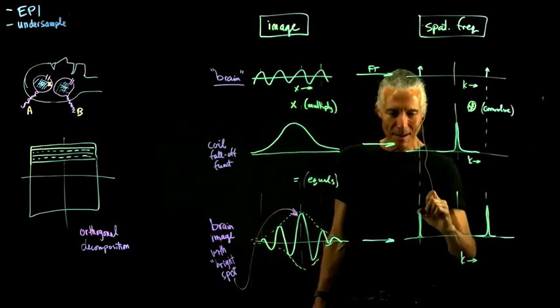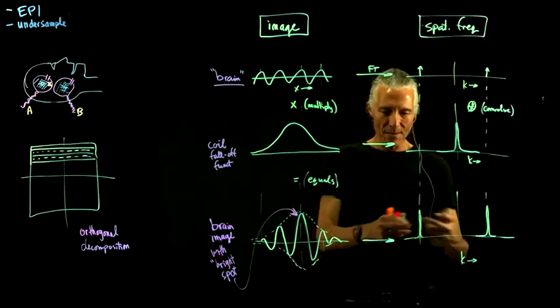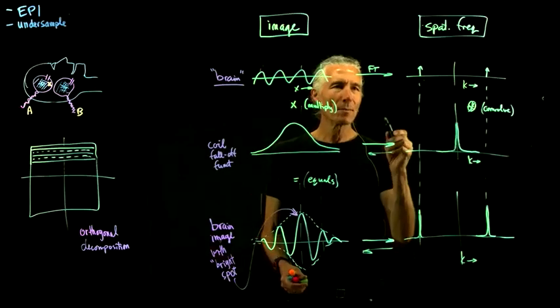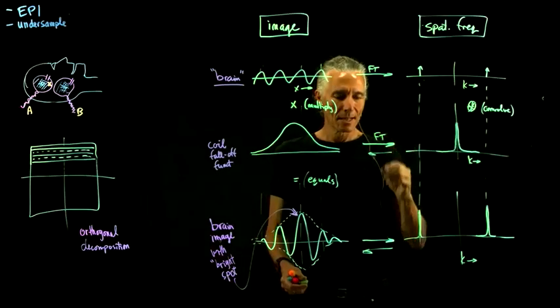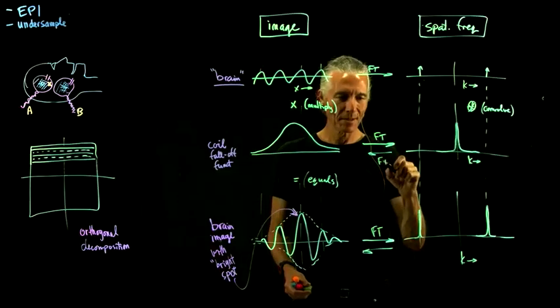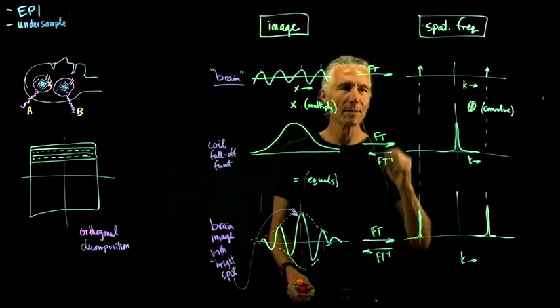Okay, but now what's happened? If we take the inverse Fourier transform of this, it's important to keep in mind that this is not blurring the image. I had a little mental garden path mistake on that. It doesn't blur the image.